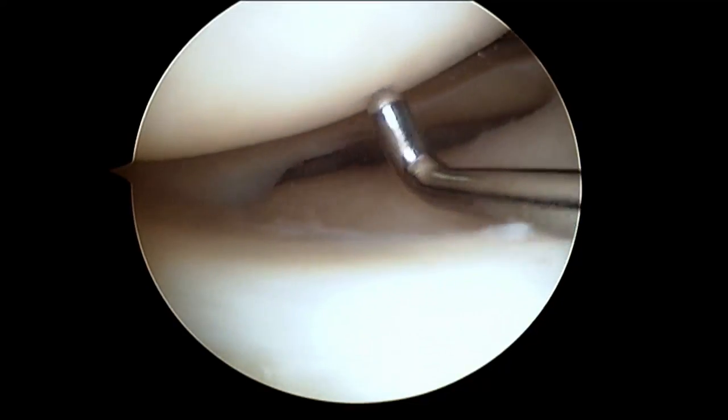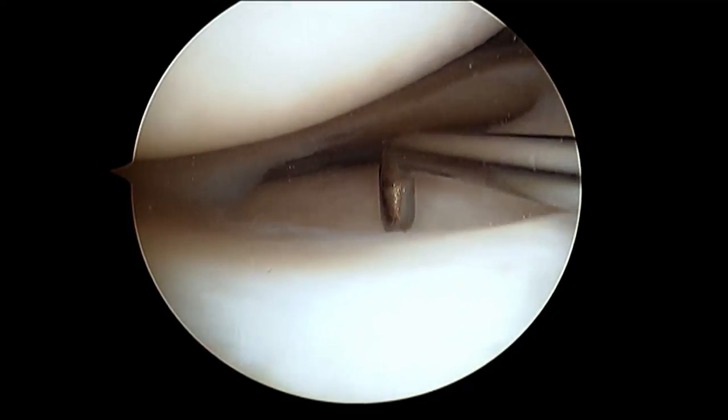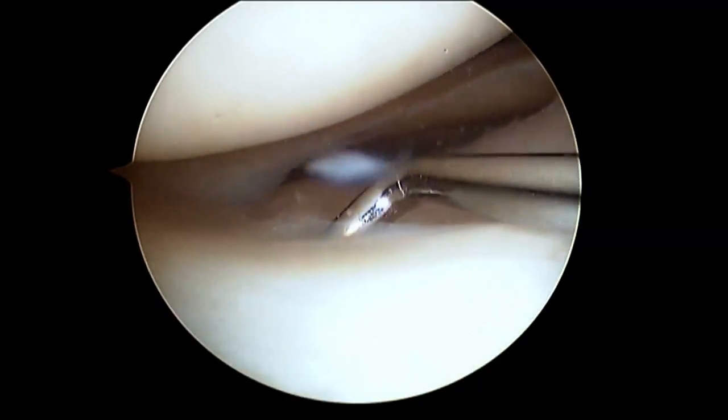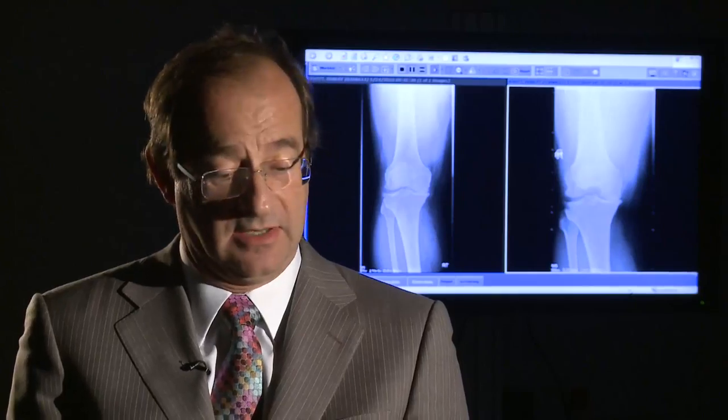We look at the whole knee joint surface and can address conditions such as a torn cartilage, ligaments, removal of loose bodies, and simple operations on articular cartilage, which is the lining over the joint. Those are the common operations we do with arthroscopy of the knee.